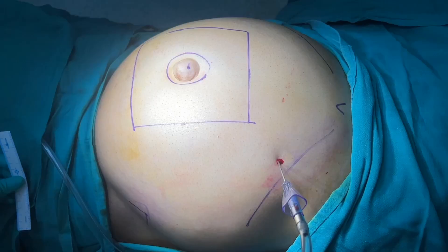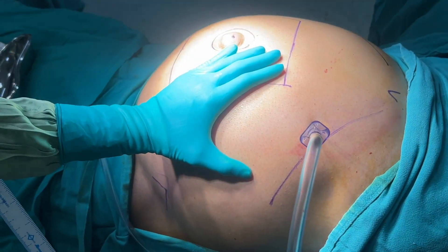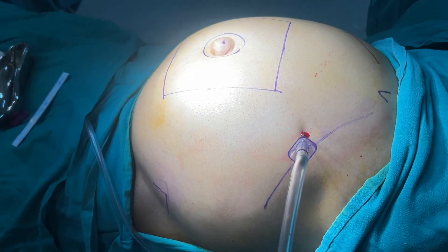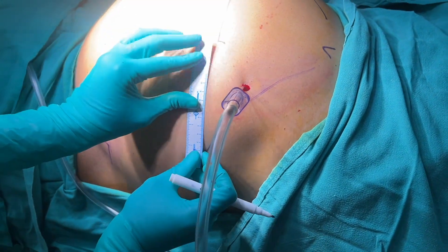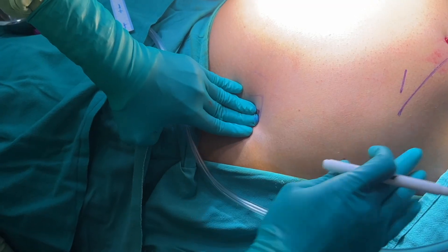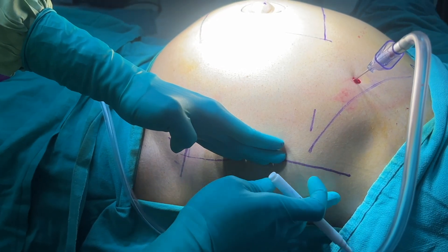This patient has good abdominal panels — meaning optimal space for port placement. Patients like this are ideal to start your robotic or laparoscopic TAPP journey for ventral hernias: a BMI of around 30, male patient, primary umbilical hernias with good abdominal panels. The level of the costal margin is marked at almost 10 centimeters; normally we keep at 7 to 8 centimeters, but since this patient has good panels we went further laterally.